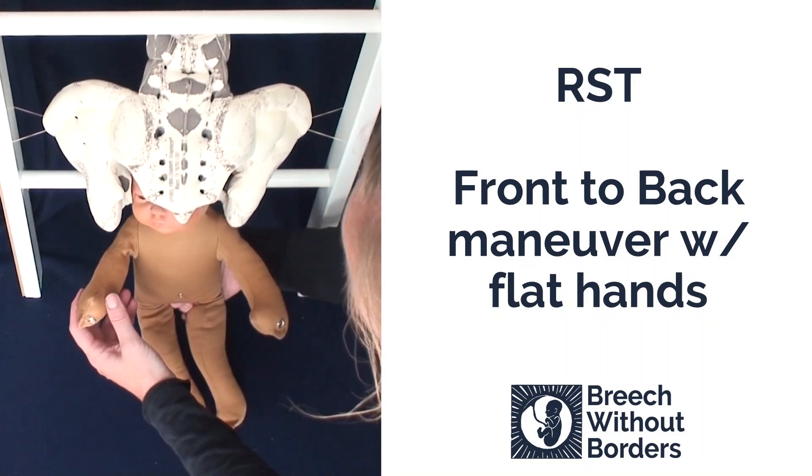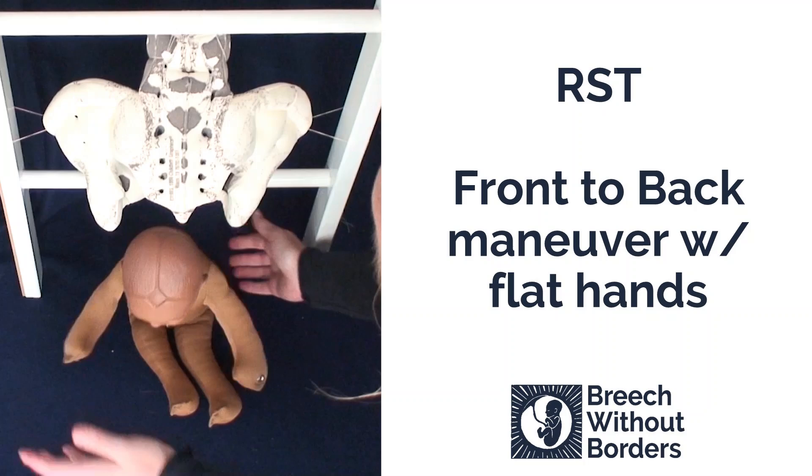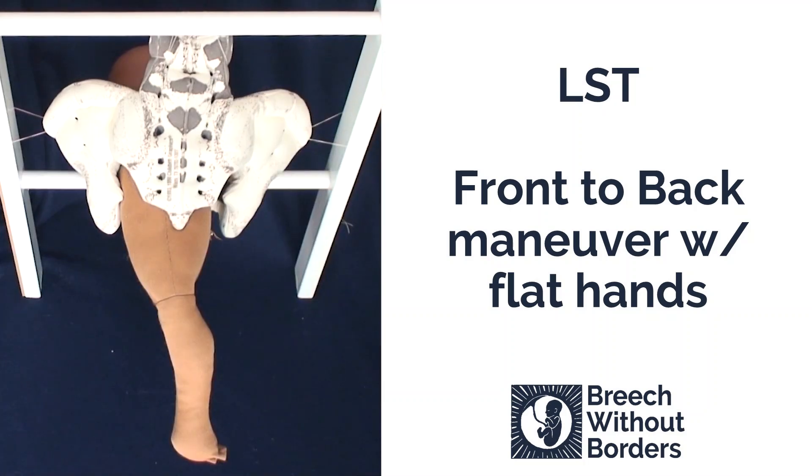Now the baby's head can be born. This baby is LST, left sacrum transverse, with a trapped anterior arm.